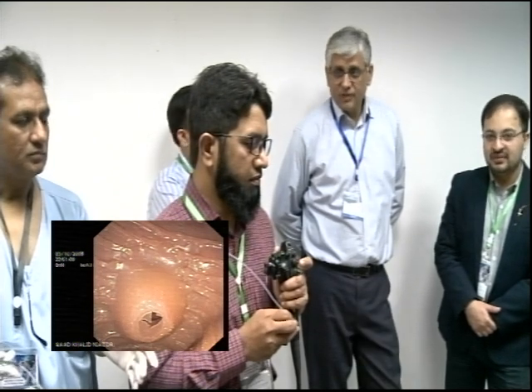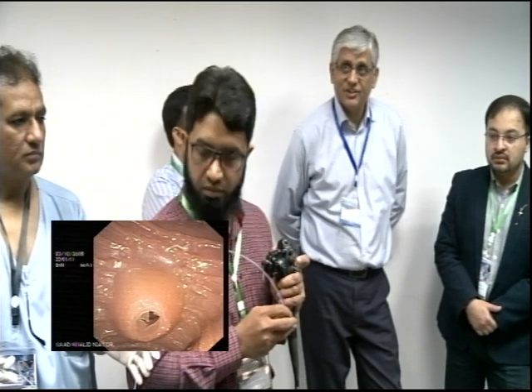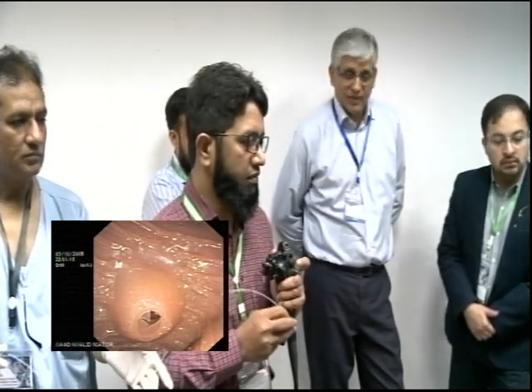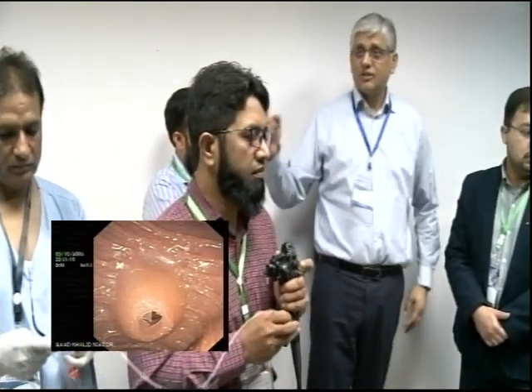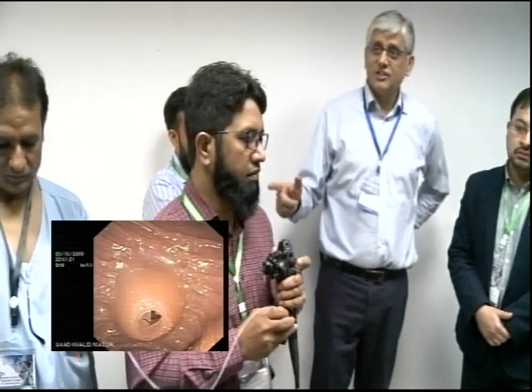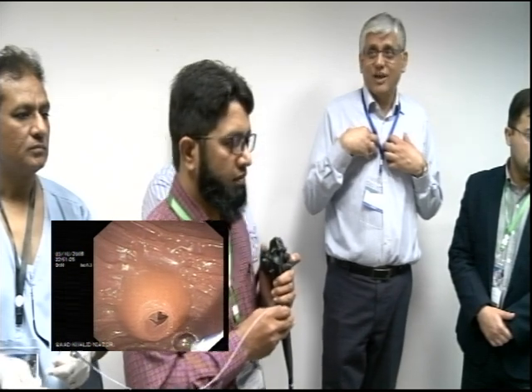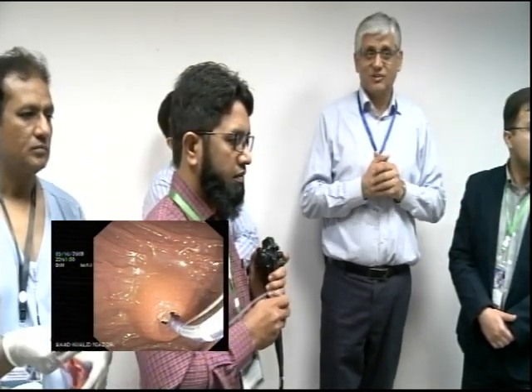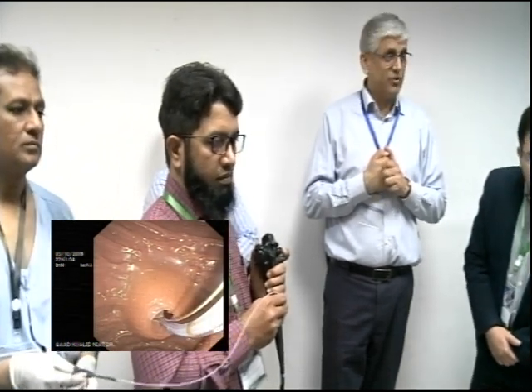Always talk to them so they understand what you're doing, because everything is about exchanges in ERCP. No matter what you're doing, if you're cannulating, putting a wire in, and taking the cannula out, they need to understand what they have to do. They know exactly what I want, they know what Vakar wants, they'll guess what Dr. Mustafa wants, but they won't know what you want. So you need to make that understanding.